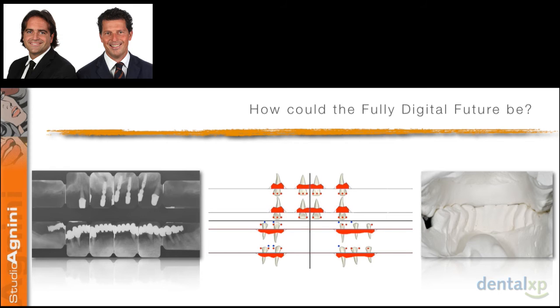We can see, for example, the problematic in the lower arch of the remaining abutments. We can see that there are two implants that are failing on the maxilla. We can see that it's not only an aesthetic issue, but it's also a functional issue. Look, for example, at this particular picture of the study model, where you can see how the function is completely off in this patient.